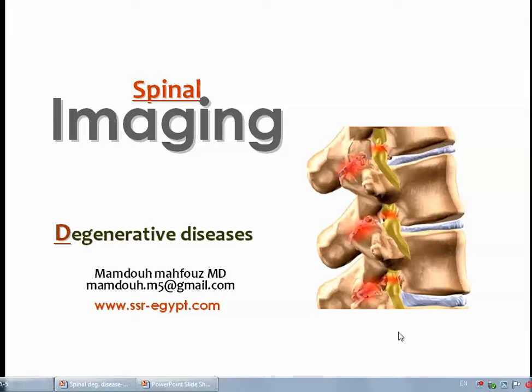Dear colleagues, this is the second talk in the series of spinal imaging, and as I have said before, we will discuss inshallah the degenerative diseases of the spine, which will be divided into two parts.